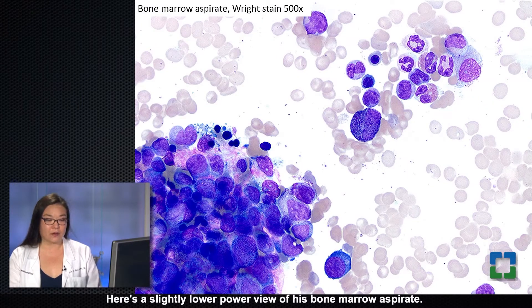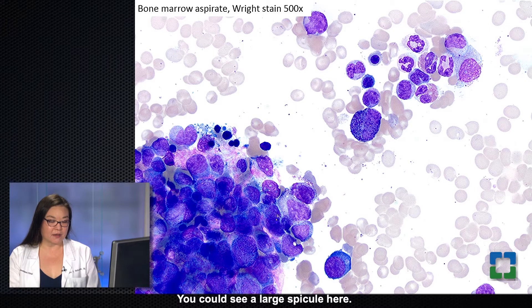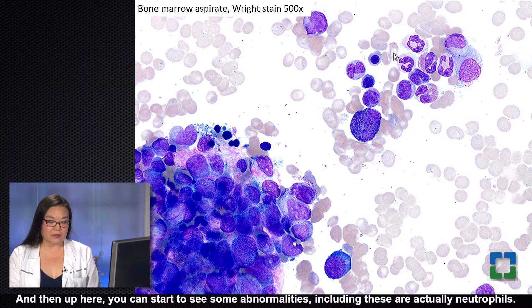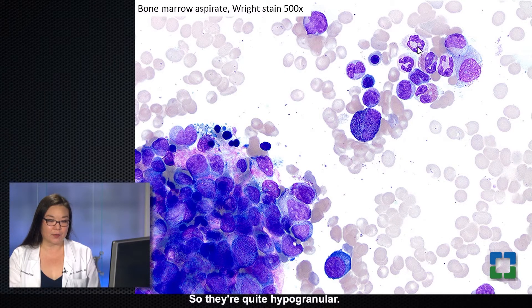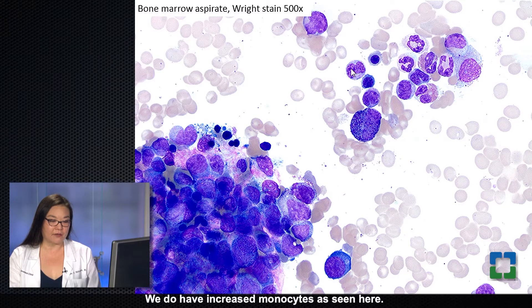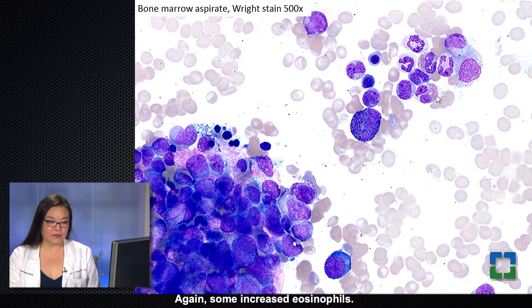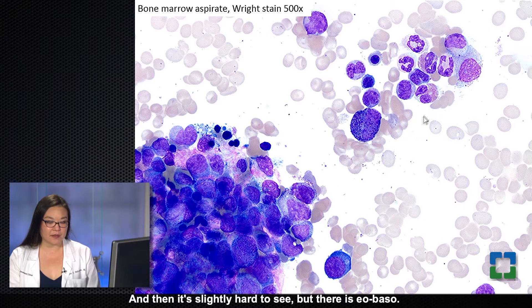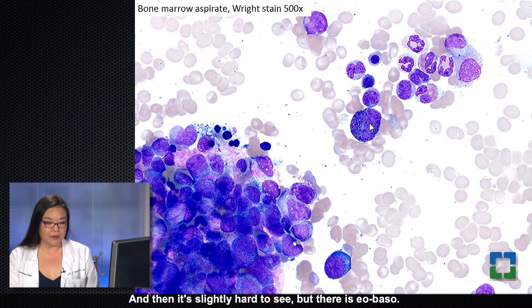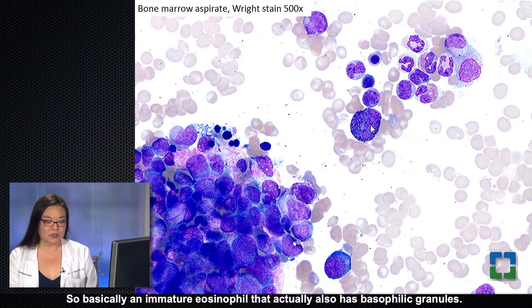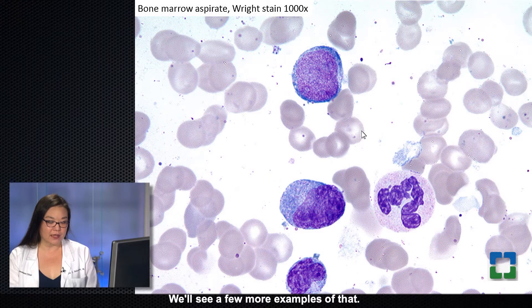Here's a slightly lower power view of his bone marrow aspirate. You can see a large spicule here, so this is a very nice sample. Up here you can start to see some abnormalities, including hypogranular neutrophils. We do have increased monocytes and some increased eosinophils, and then there's also an eobazo — basically an immature eosinophil that actually also has basophil granules. We'll see a few more examples of that.